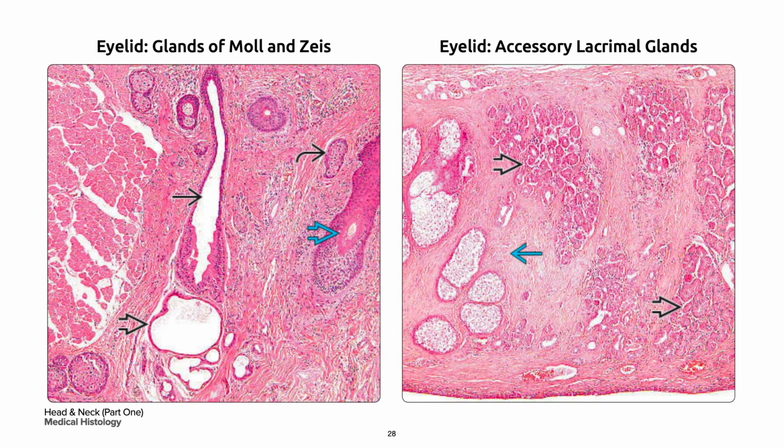On your right, accessory lacrimal glands in bold black arrow may be identified within the most superior and inferior portions of your eyelids at the bases of the tarsal plates in single blue arrow, and also in the superior and inferior fornices of your conjunctiva.